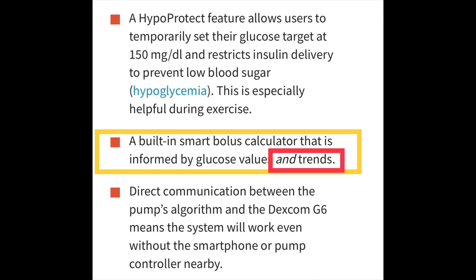The smart bolus calculator works like other pumps by factoring in carbs you're about to eat, insulin on board, and your current Dexcom G6 blood sugar. But what's new is that it also looks at your current trend to predict what your bolus should be. So if it suggests five units, it doesn't stop there — it checks whether your blood sugar is trending higher or lower and adjusts the bolus accordingly. This should help reduce both post-meal hypoglycemia events and post-meal blood sugar elevations.